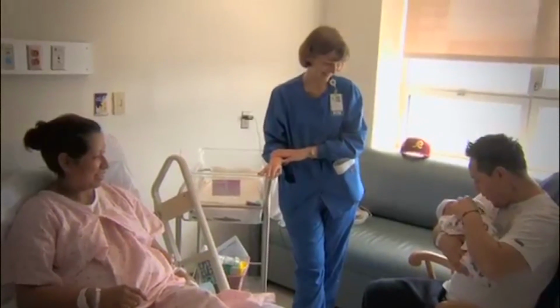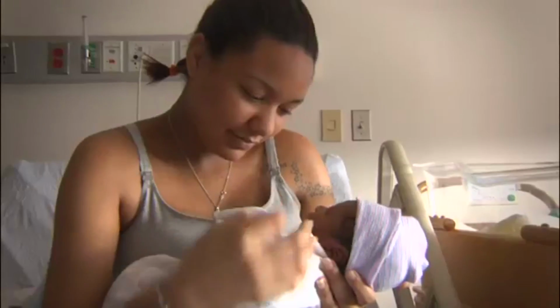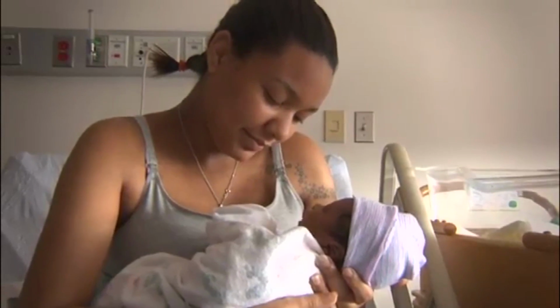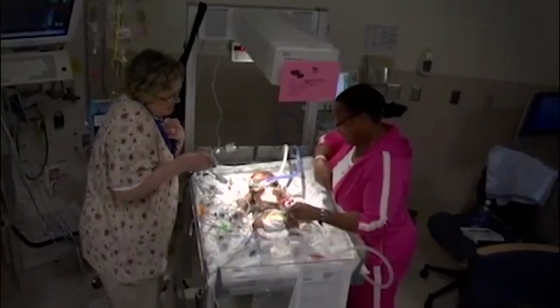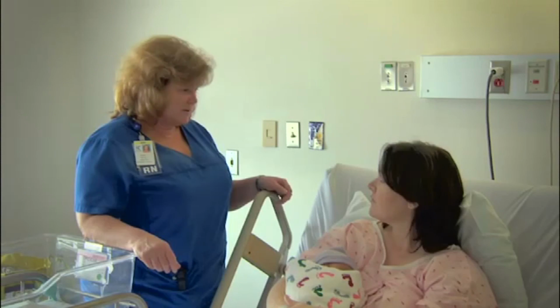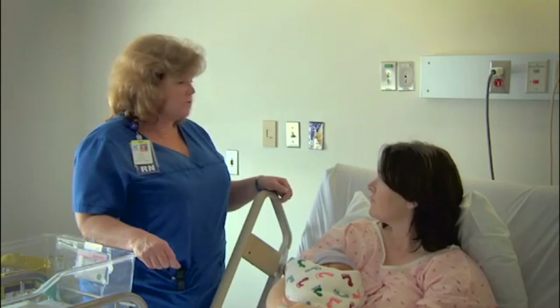It's important for the nurses to educate the parents prior to the screening. It's very important that parents understand that this screening test does detect many babies with critical CHD. However, it will not detect all babies who are born with CHD or critical CHD. This test is a simple test that has to do with congenital heart disease.